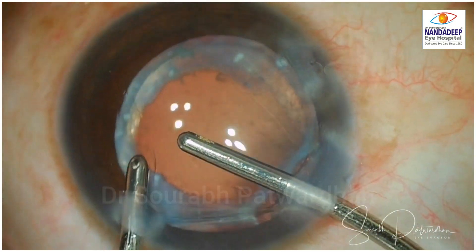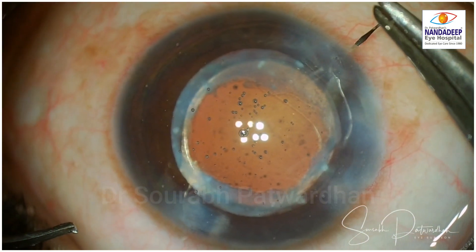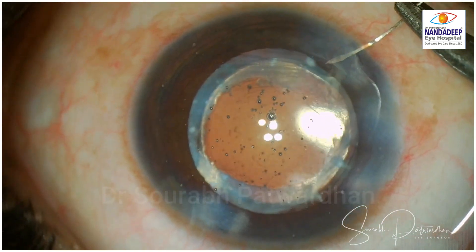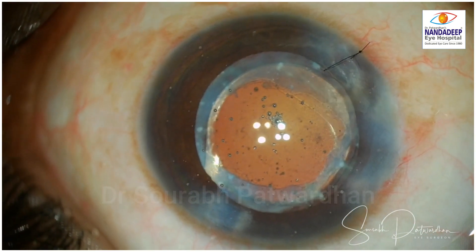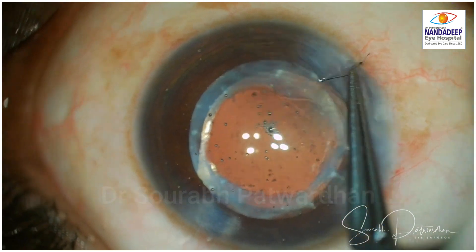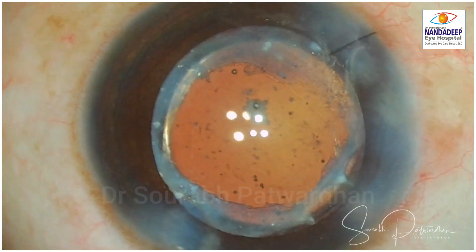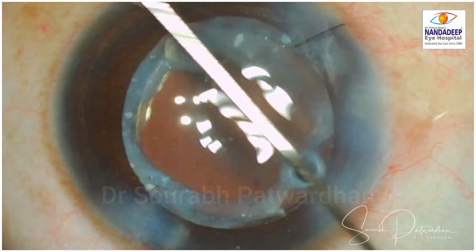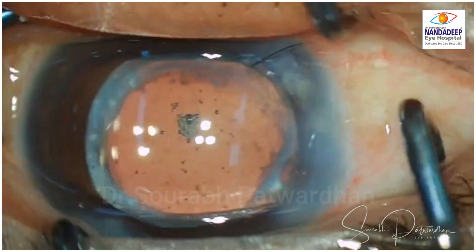It is a good idea to step up steroids in the post-operative period. This is what I was talking about — the incision was made a little ragged and it was leaking, so I had to suture it at the end of surgery. No problem with that — never shy away from suturing a leaky incision. Many times you land up in trouble because you don't suture it on the table, and then post-operatively you have a flat anterior chamber and have to take the patient back to the table again. Always make sure the wounds are watertight and closed.